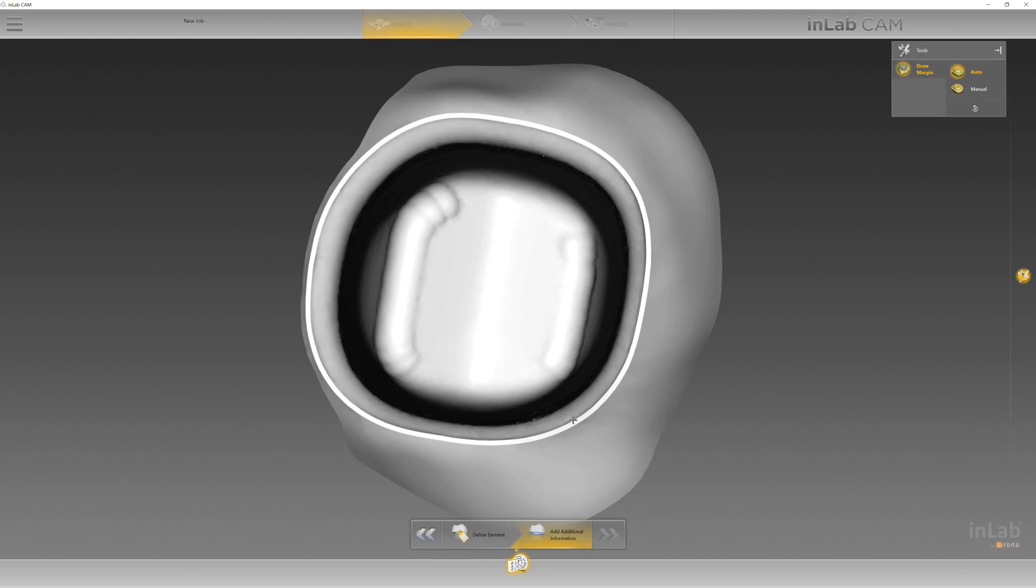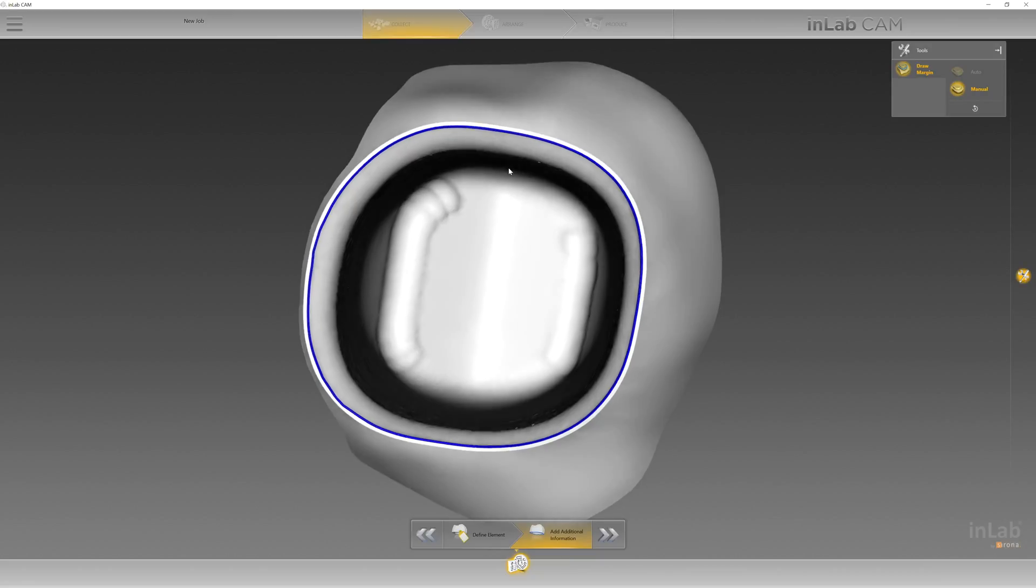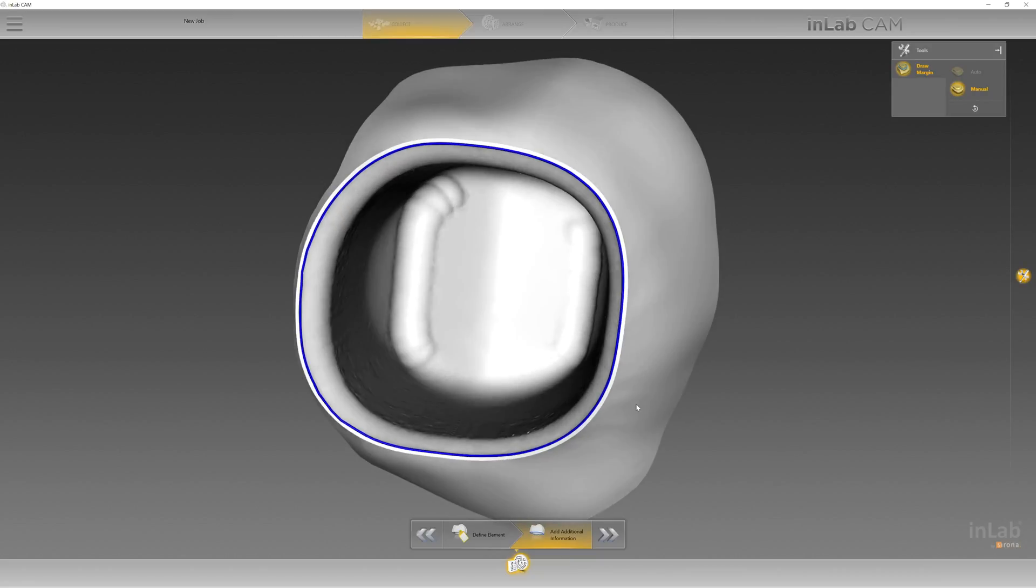Now I'll need to add in my margin. It's the auto margin finder and sometimes depending on the quality of your STL file, you can go back in here and correct any type of issues you might have with your margin. But typically they come in pretty quick and clean. You move forward.